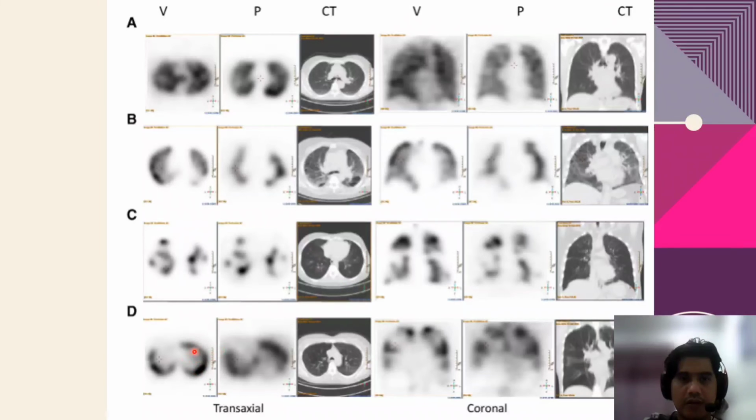When we look at patient D, triple match in emphysema, severely abnormal VQ SPECT with matched reduced ventilation and perfusion, which is worse in the lower part of the lung, matching with the CT finding of emphysema, 30% emphysema. The patient has severe airway obstruction, hyperinflation, and low diffusion capacity due to the emphysema, and the patient has alpha 1. We go to the next.